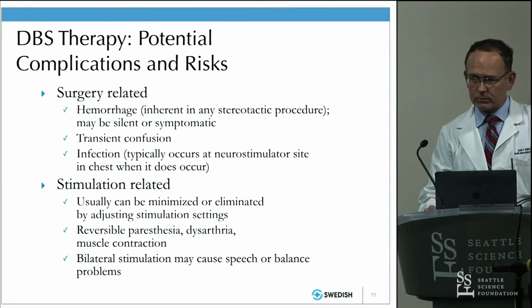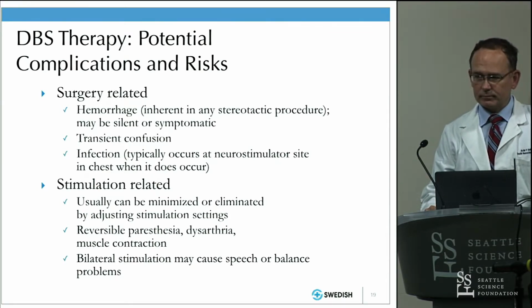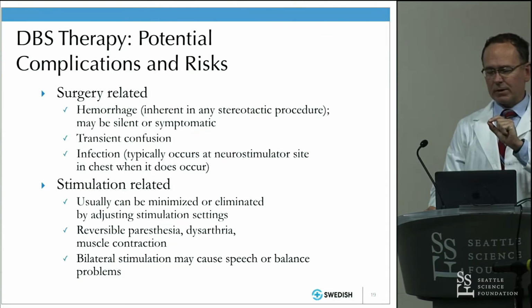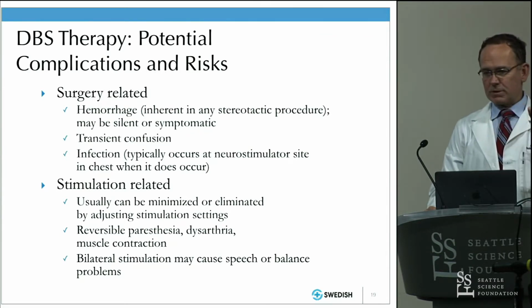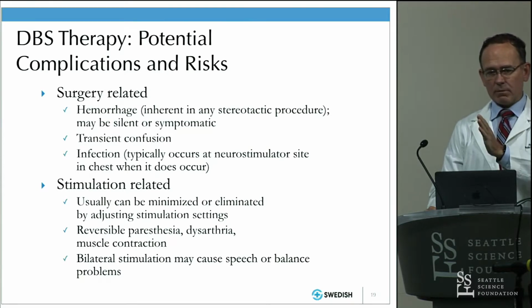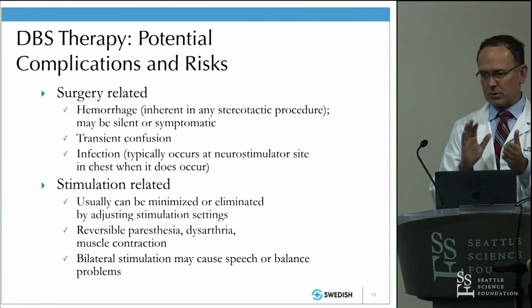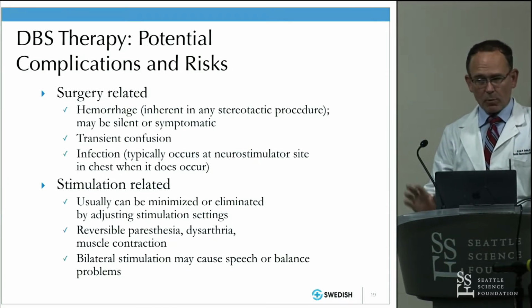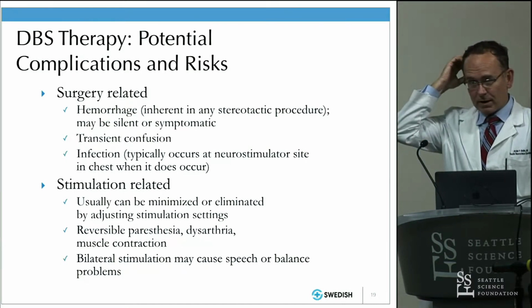How long is that interval between for a central? So we put the lead in and then put the battery in typically 1 week later for the first side, and then we program that and get it to work well, and then talk about making sure it's helping them, then talk about the other side. It's typically 3 months between the first side and the second side. There are places that put them in all at the same time, though.